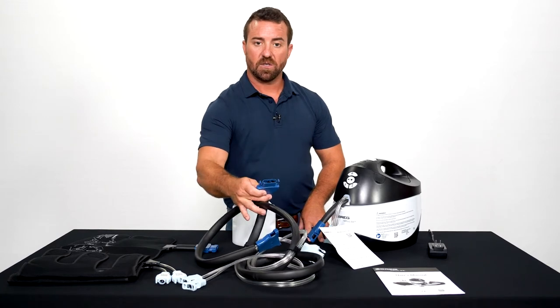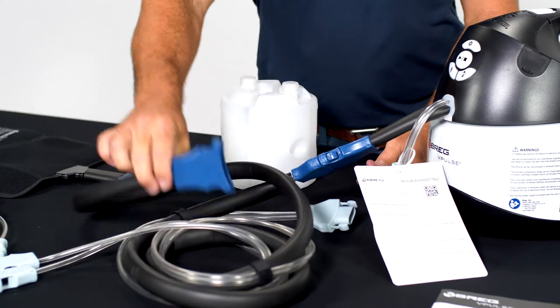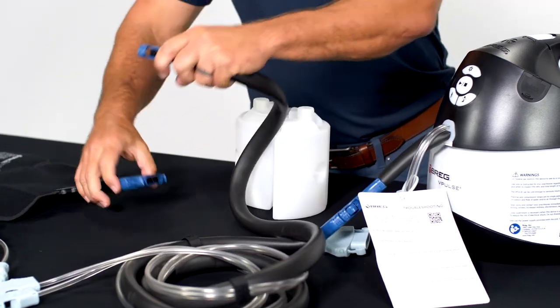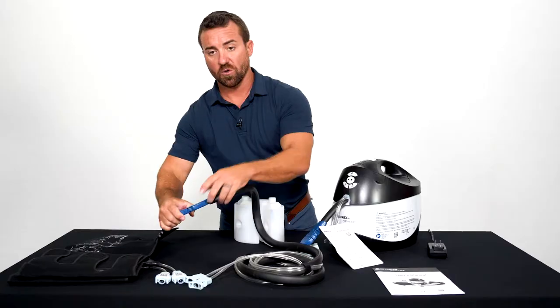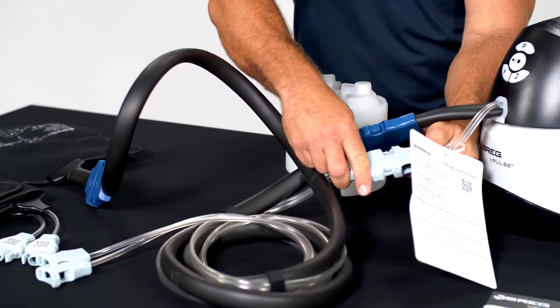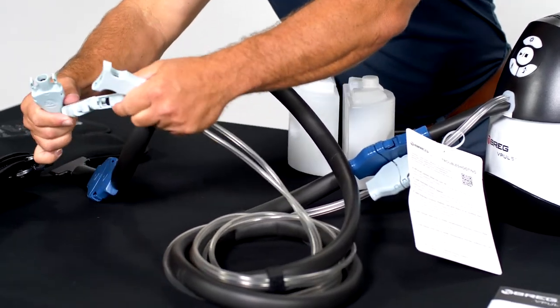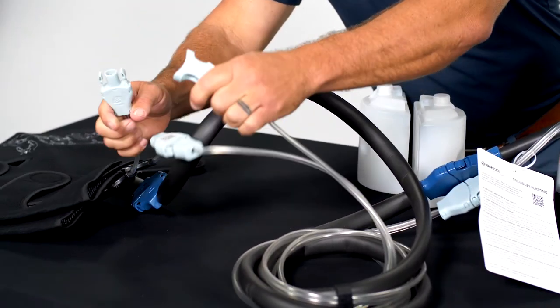First, take the one blue end and connect it to the machine. Take the other large blue end and connect to your cold compression pad. Then take the single light blue end and connect to the machine. Take the other end and connect to your calf wraps.